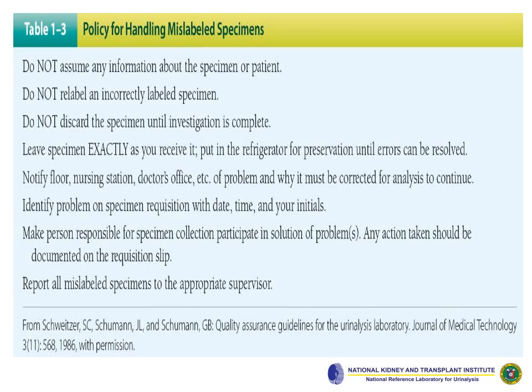Refrigerate it until all errors are resolved. Notify the sending party of the incident. Make note of the incident on the request form, indicating the date and time of the incident and your initials. Finally, report the incident to your supervisor.